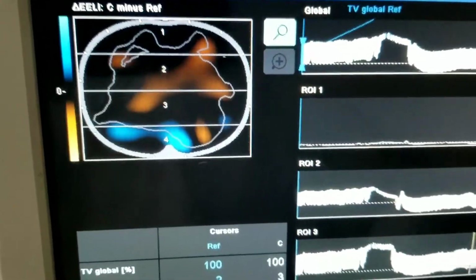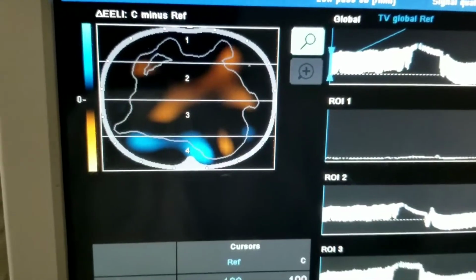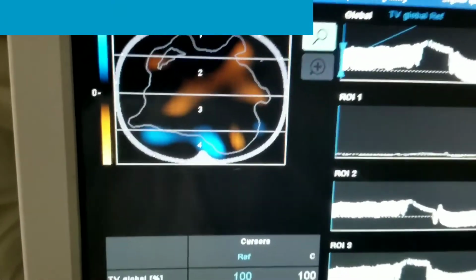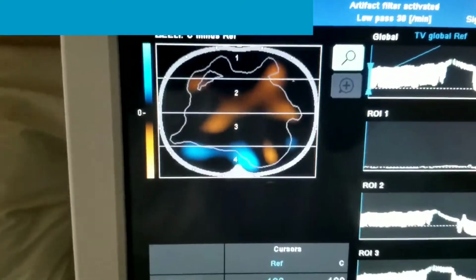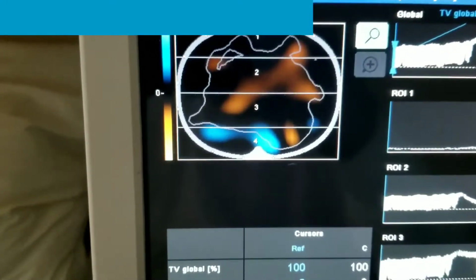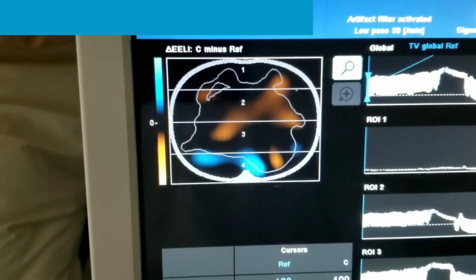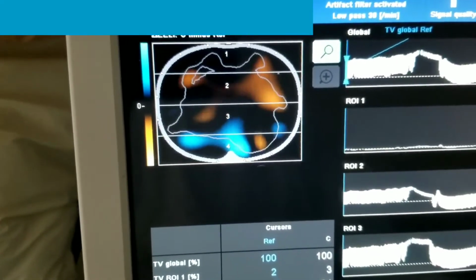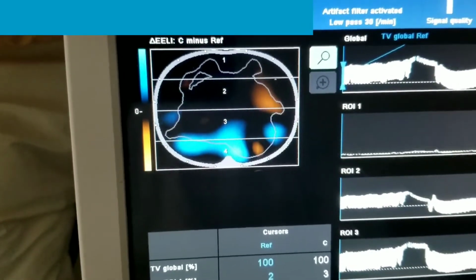And this is how with APRV, we often have to wait about 8 hours to make an assessment. Sometimes there's no improvement, and all of a sudden, by 6 to 8 hours towards the end of your shift, you're seeing drastic improvements. Not all the time, but if the potential of recruitment is there, it sometimes takes hours. All right. So we see here always good stuff happening.